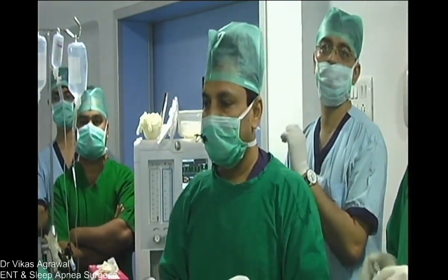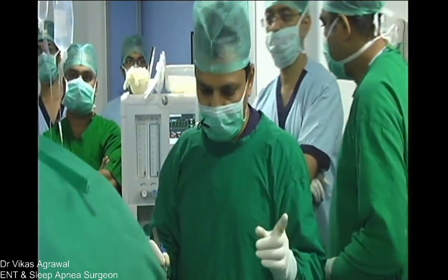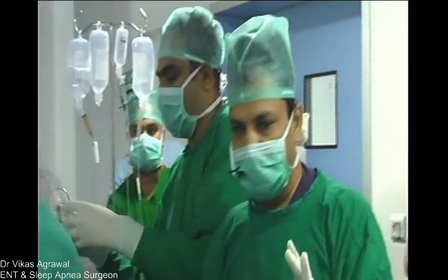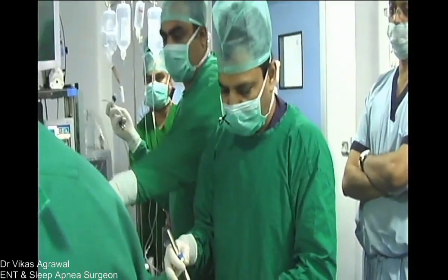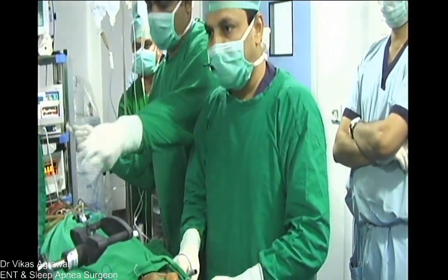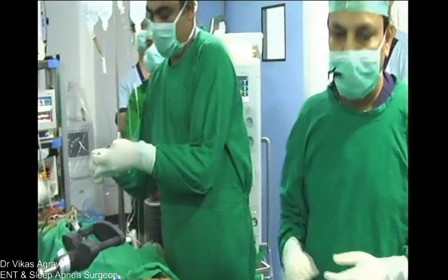Okay, are we on? Chalo. Just give me 1 second. I'm setting up the navigation unit for you, so that you can see the high septal deviation. Now, septoplasty is something I know many people will not be greatly interested in learning, but I'll show you some things which most of us, at least I, did not know till a few years back. And there's always a scare while doing high septoplasty. When you're going high, there's always a scare. So why don't you set it up fast?